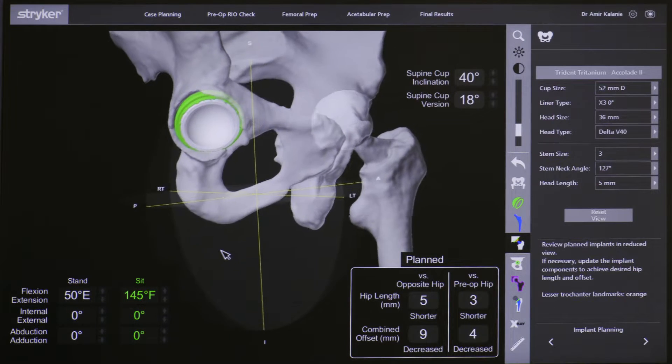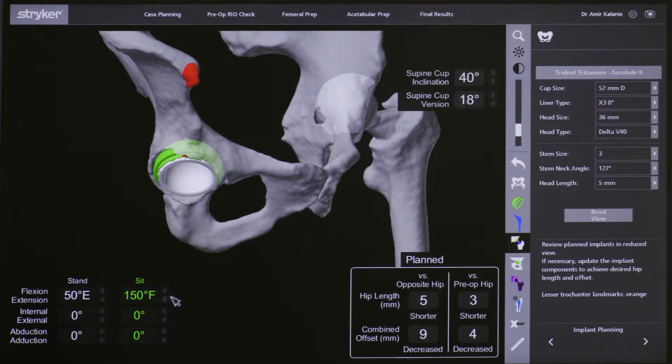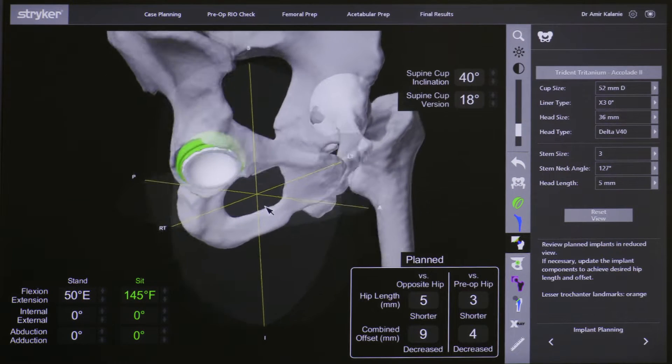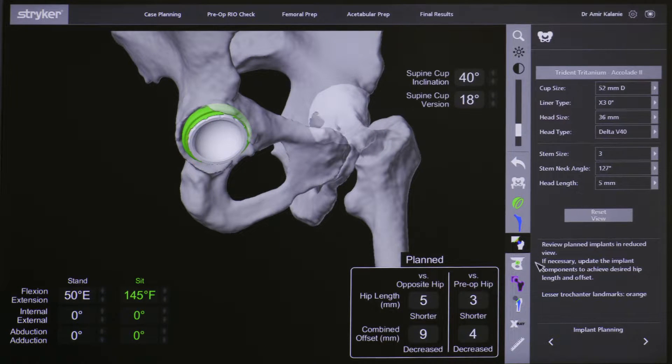Having this information before doing the surgery is obviously crucial, and it would otherwise be very difficult to detect these subtle changes without the use of such technology.